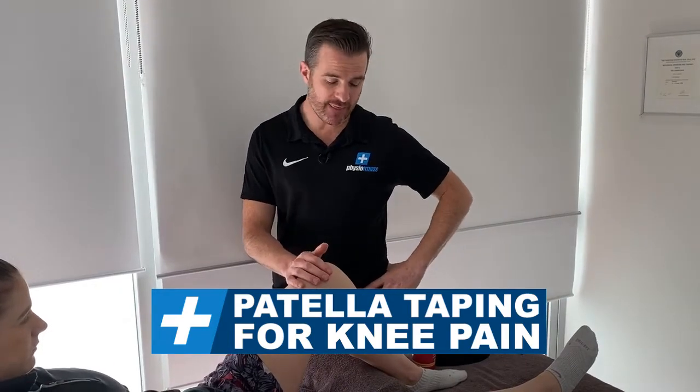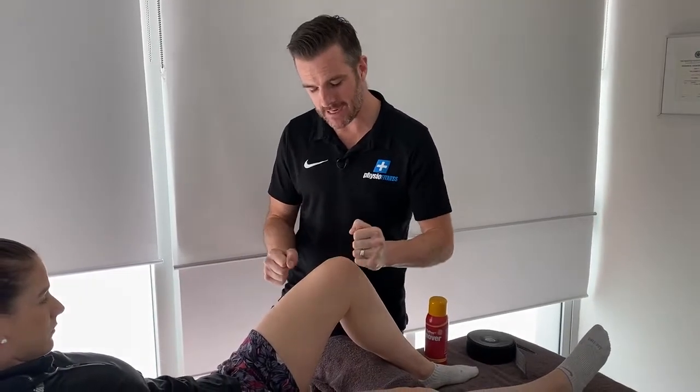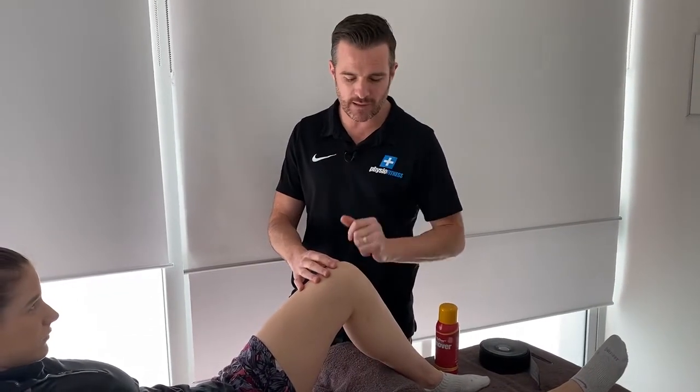Now the taping part. This taping uses Kinesio tape because we want an elastic tape — it's going to be an active tape. Rigid tape is not really going to work for this one. You want elastic because you're trying to create some drag. I use this as a patellar lift, not a tracking technique or trying to change from lateral to medial. This is simply to lift that kneecap and give it some support underneath to try and change the mechanics when the person's squatting.